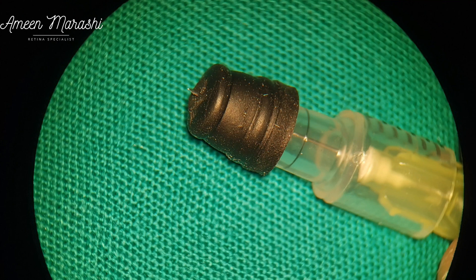The idea is to make a needle that is cheap and easy, with available materials. This needle should only penetrate 1000 microns into the conjunctival-scleral complex at the pars plana, 4 mm from the limbus, to inject triamcinolone alone in the suprachoroidal space.